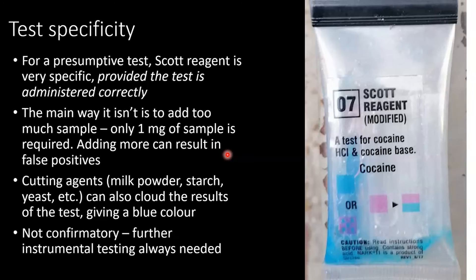In terms of specificity, Scott's reagent is relatively accurate compared with other presumptive tests, but it needs to be administered correctly. The main way that people don't administer the test correctly is by exceeding the one milligram of sample — adding more drug than required can generate a false positive result. Similarly, common cutting agents such as milk powder, starch, and yeast can cloud the results by also giving a blue colour that mimics cocaine. It's worth stating that none of these drug testing kits are confirmatory — you always need to do instrumental testing to confirm the result.